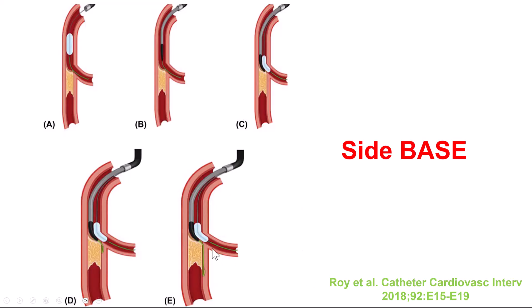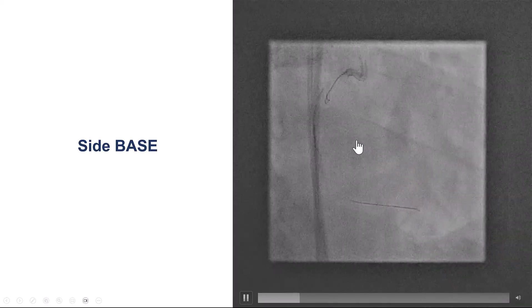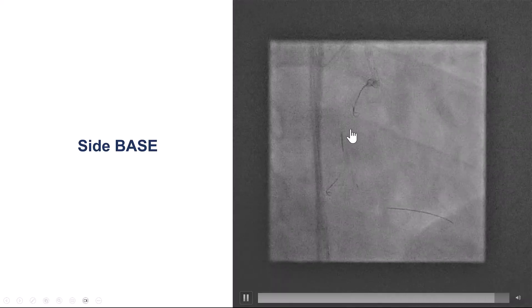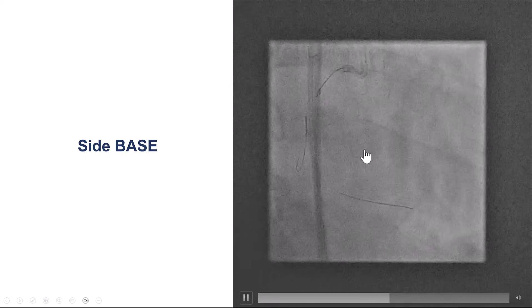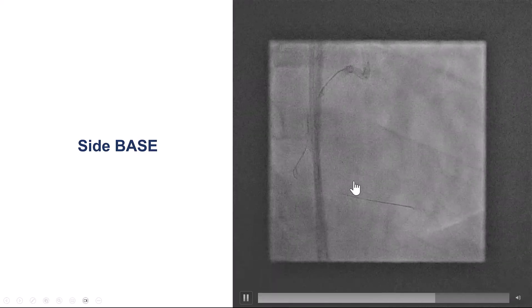To get out of the side branch and into the main vessel, we used the Side BASE technique — very similar to BASE, but the balloon is placed halfway into the main vessel and halfway into the side branch that was entered with the previous wire. This prevents another wire from following the side branch pathway and instead directs it down the extra-plaque space in the main vessel. We brought in a Sasuke, introduced a second guide wire, and inflated a 2.0 mm balloon inside the acute marginal branch. The knuckle formed and moved along the course of the vessel — a successful Side BASE technique.